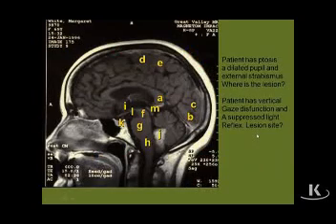Our next image is an MRI of the medial aspect of my mother's hemisphere, taken 13 years ago or so when she had a slight hemorrhagic stroke, indicated by letter J on this figure. But it allowed me to label a series of neuronal structures in this MRI and ask questions about them.